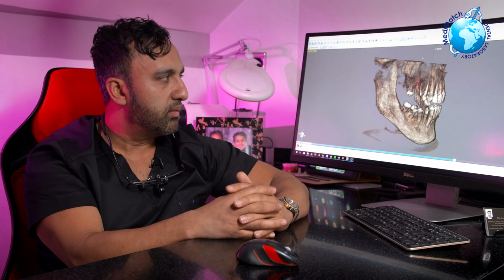Interestingly as well, we engaged the floor of the sinus on the back implant in the upper right 6 area, and that is a cortical plate of bone, and we gained over 35 to 40 Newton centimeters of torque in this position. And we were able to give this patient a set of temporary acrylic teeth to bite on straight away to load these implants up.